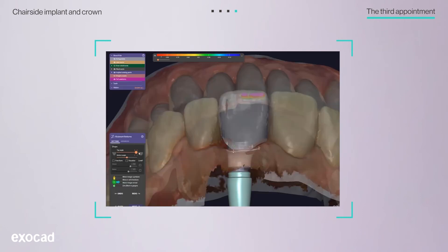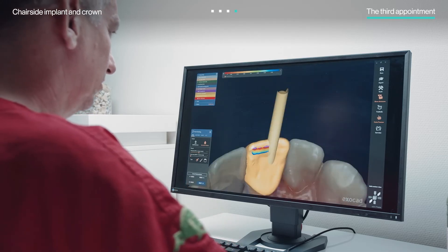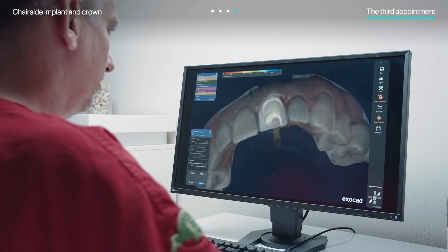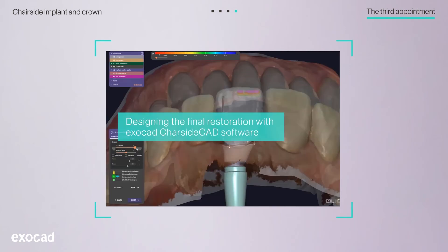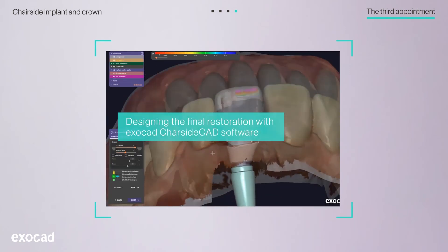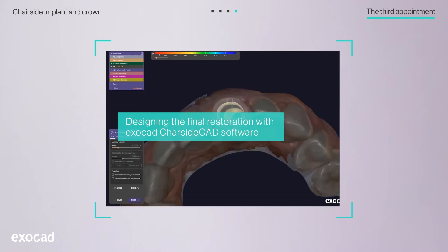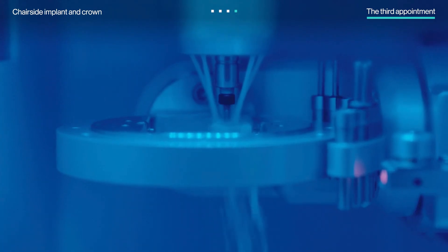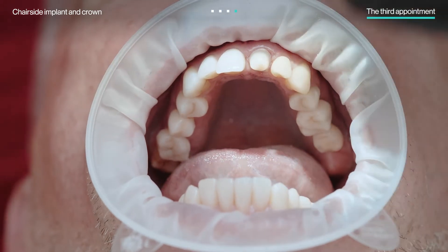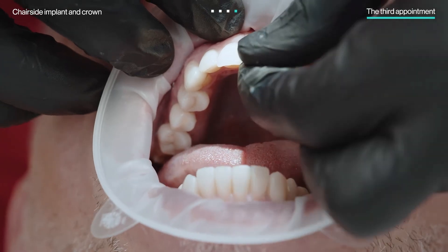After scanning, he put the provisional crown back in place and imported all the files to his ExoCAD software. With the final scans imported, Dr. Radmacher continued working on the ExoCAD Chairside CAD software for the final restoration design. He then produced it with his chairside milling machine. This fluid workflow allowed Dr. Radmacher to deliver the final restoration on the same day as the scanning.